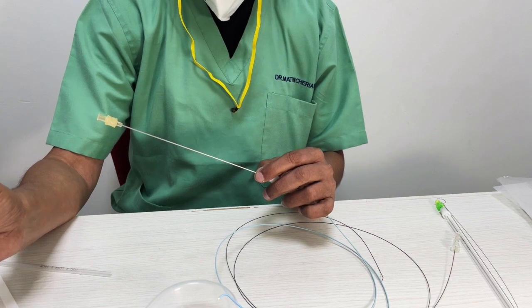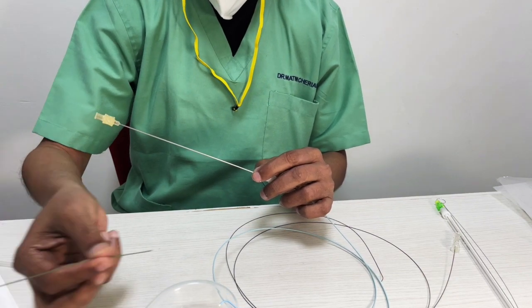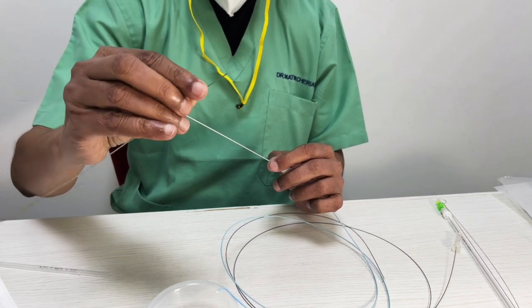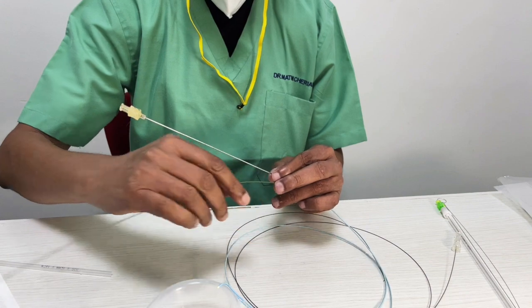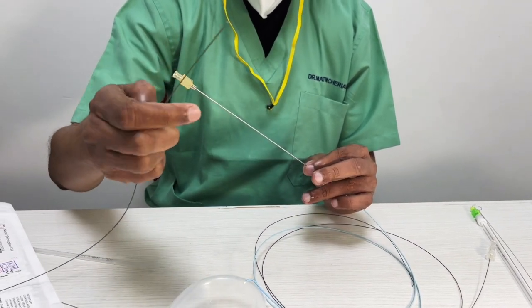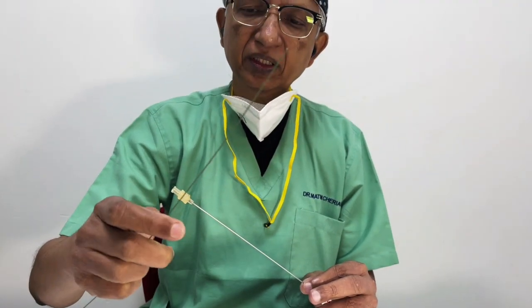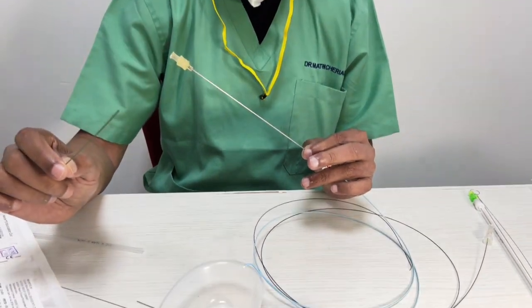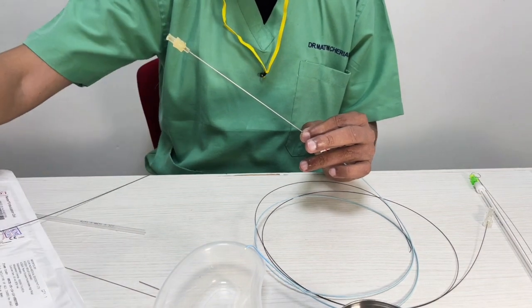Remember, any straight guide wire will work, but ideally it should be absolutely straight, and it should be soft at the tip. Now remember, this is a very important thing to understand. Whatever wire you use, it should be very soft. The softer the distal 15 or 20 centimeters, the easier it is to push, because otherwise these tips will not go through tortuous anatomy. For example, you're trying to put a coil across the aortic bifurcation, and if you have a wire which is stiff, let me show you the reverse end to make you understand.